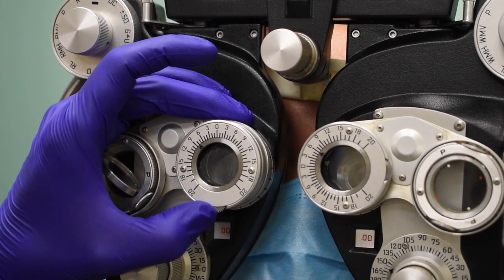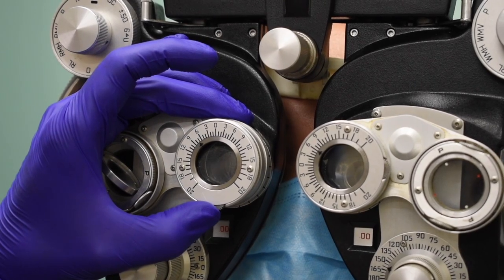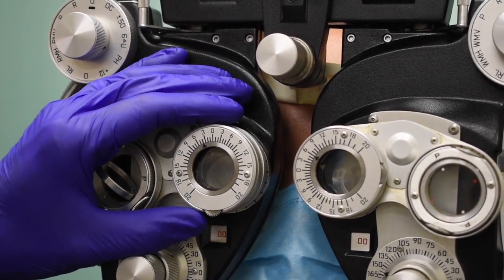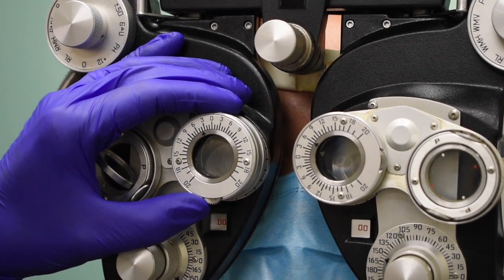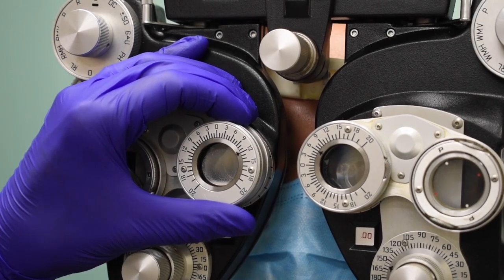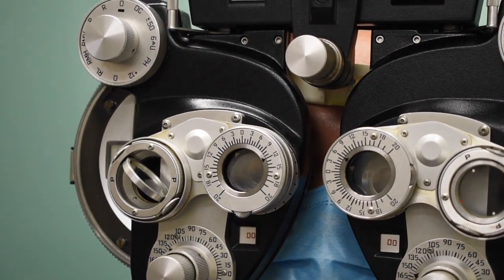There. Good. I'm going to go past, keep that bottom on focus. Tell me when they line up again. There. Good. So I've got 4 prism diopters ESO because it's base out. So 4-4 ESO. Close your eyes for a second. I'm going to reset it. So I've got 12 base in, 6 base up.